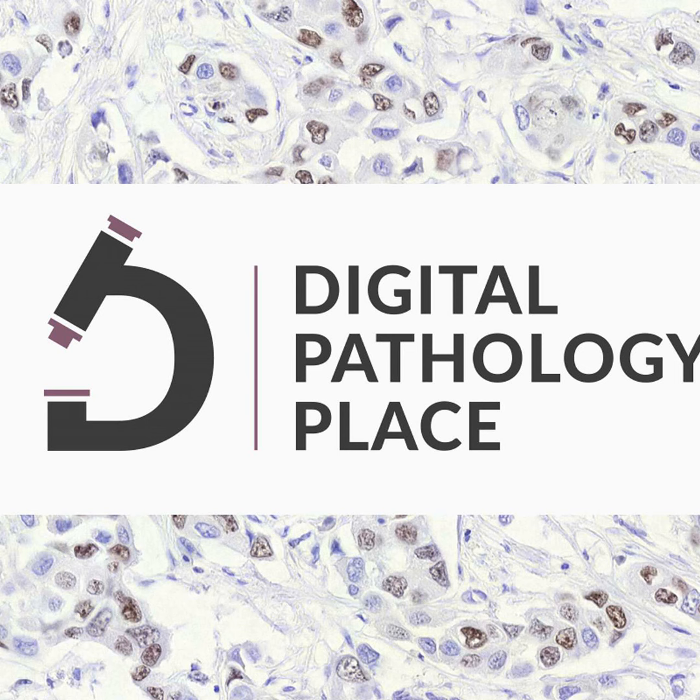Yeah, but I guess it's also a pain for the hospital sector, because medical imaging has been used to working with DICOM for more than 20 years now. They have all the infrastructure already. They have the culture of working with this format, and this format has a lot of advantages. But we have to face the situation that one pathology image is very much bigger than a medical imaging one in terms of size in pixels, weight, and everything. Sometimes I make simulations, and we can say that one slide can replace 2,000 X-rays within the PACS servers. So the difference is really huge.